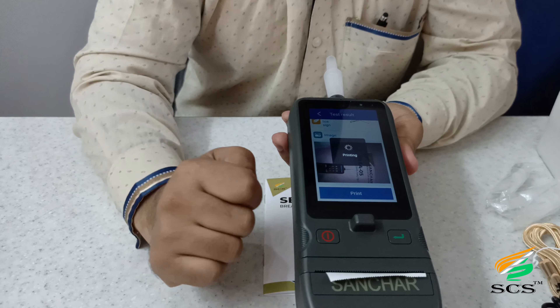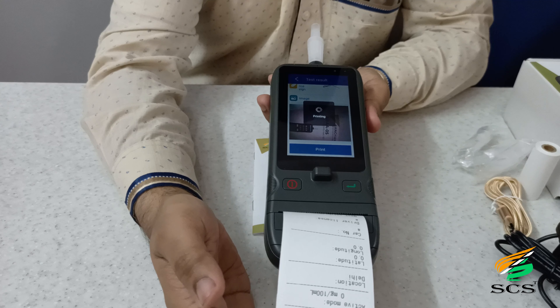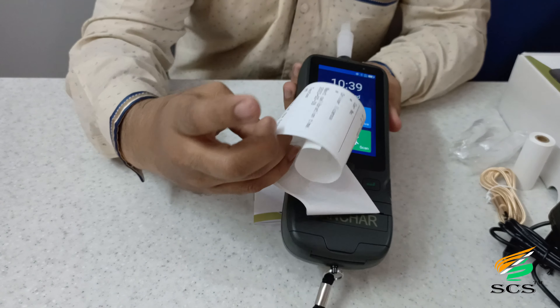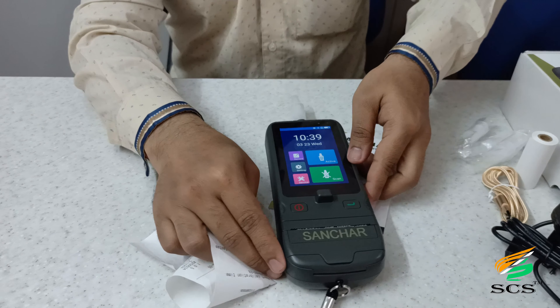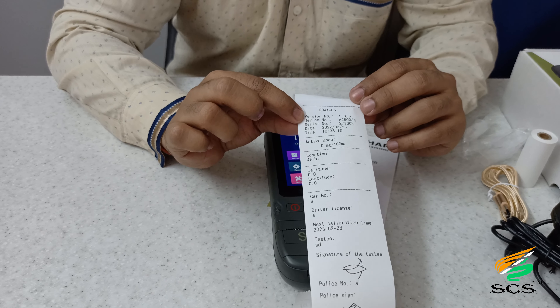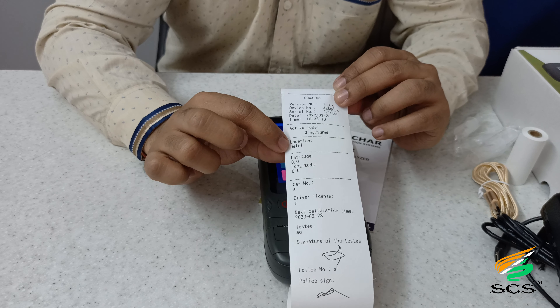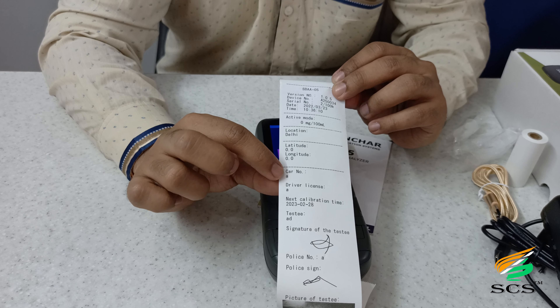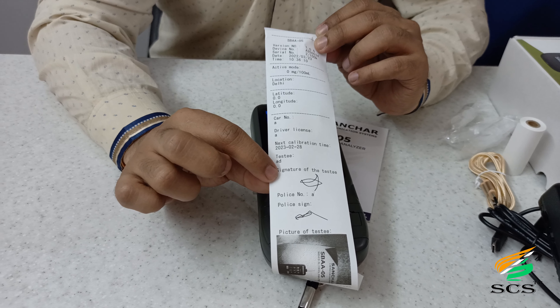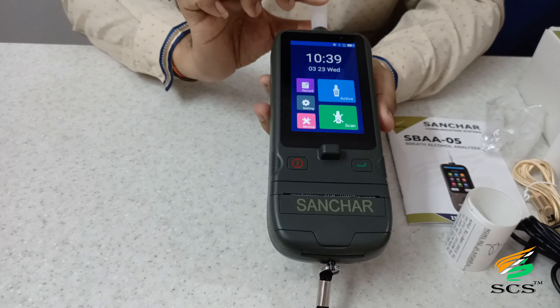If you want to take a print, click on the print button. After clicking, the print will come out from the device's built-in thermal printer. The print receipt shows the model name and many details including version number, device number, serial number, date and time, alcohol mode, location, latitude, longitude, car number, driver license, next calibration time, name of the person tested, signature, police number, police sign, and image.